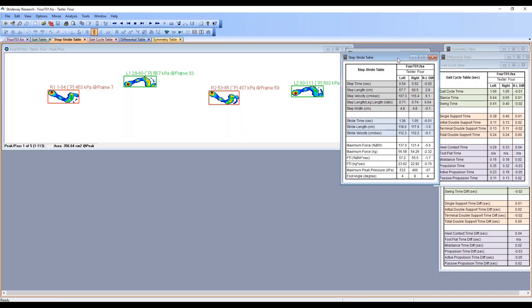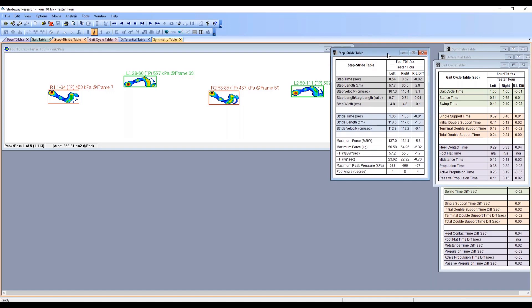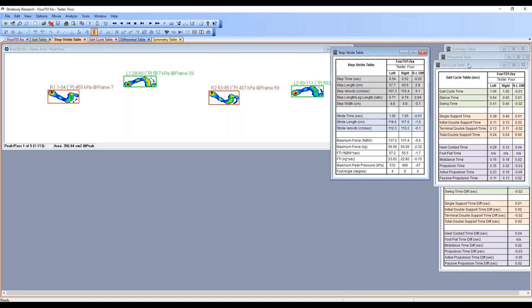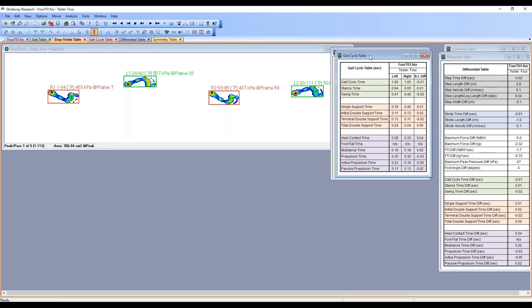We've got our gait cycle table showing stance time, swing time - these are all averages in seconds. You can see our units of measure and then the different phases of the gate cycle: single support time, initial double support, foot flat time, active propulsion time, and passive propulsive time.